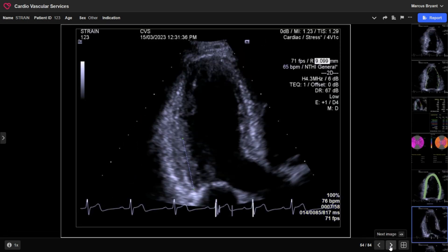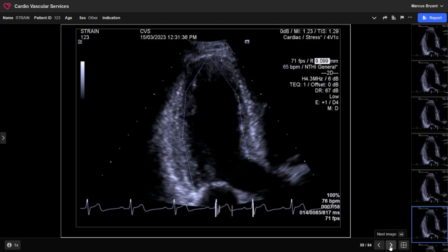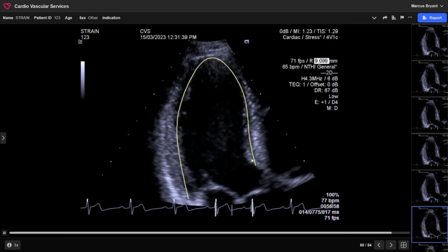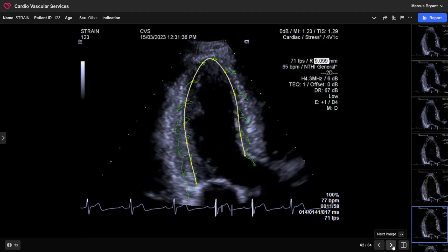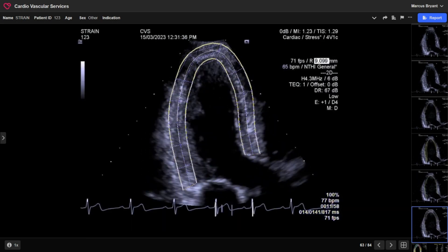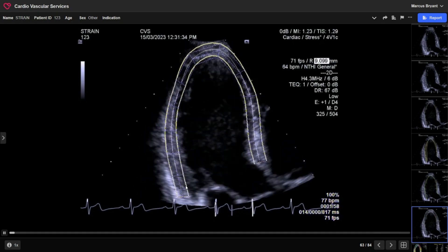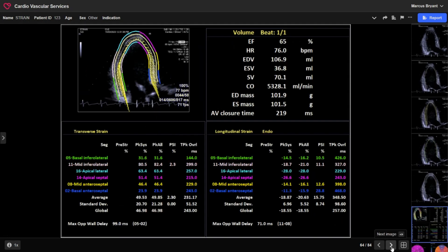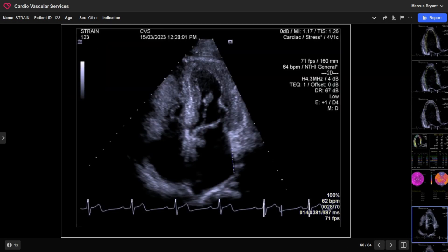Similarly with the long axis, I repeat the same thing using those seven different points. There's a question of how far you go down into the outflow tract - that's a bit of trial and error. In some ways I probably should have repositioned one point, but it's not too bad. When I look at the actual strain it's tracking well, and amongst various other displays you can also see the radial strain occurring as the walls actually thicken. The overall global longitudinal strain is not too bad, and all the values are pretty equal to each other which makes me trust it - the color distribution looks pretty good as well.